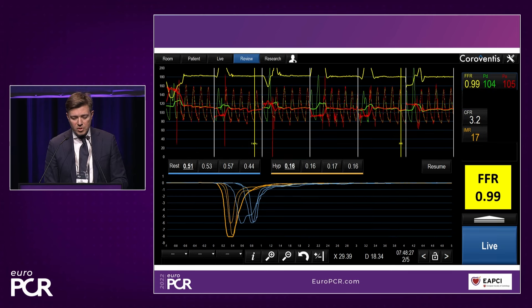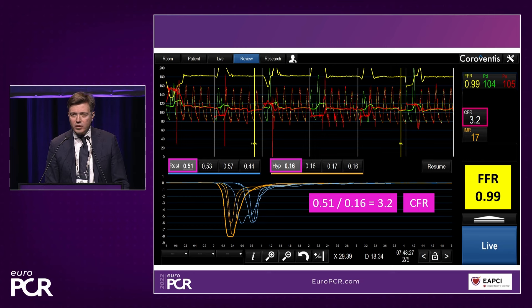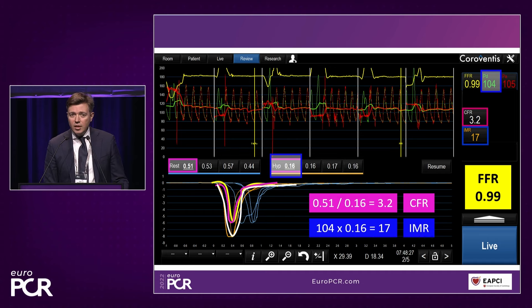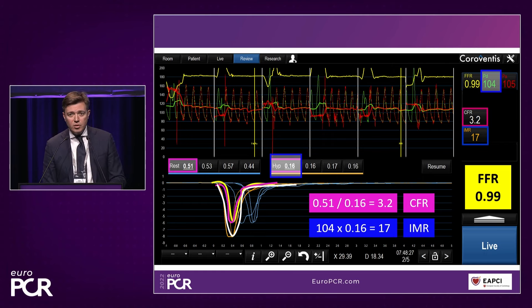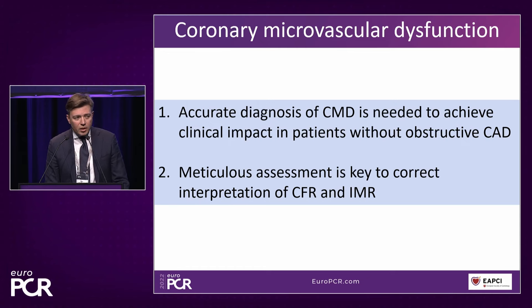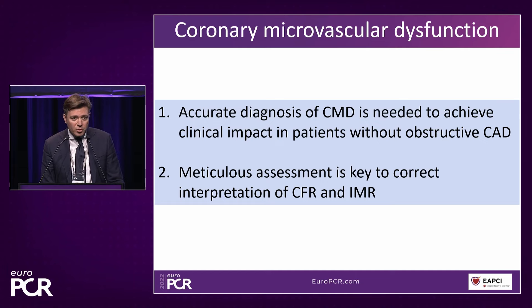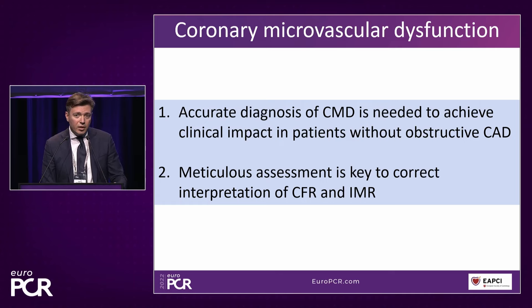We first checked for pressure drift — there was none after the measurement. Looking at the new values, they are completely different: CFR of 3.2 and IMR of 17. The tracings now look more in line. We have a completely new conclusion — CMD was actually ruled out in this patient. The key takeaway is that meticulous assessment is the key to correct interpretation. If we are not sure about the output data, we cannot put it in the clinical context and make the value for the patient.